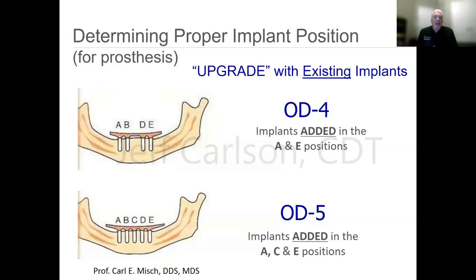And so by planning where you put those implants, think about where you could put future implants. Because a lot of patients, I see it very often, come back and the doctor says, okay, Jeff, give me a surgical guide. And it's like, wow, the ideal positions are kind of messed up here because of where they were placed initially. So again, things to think about.